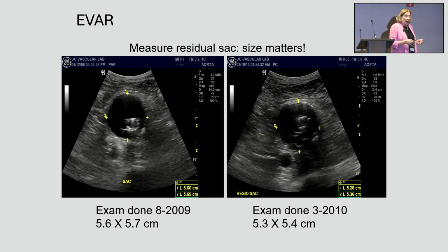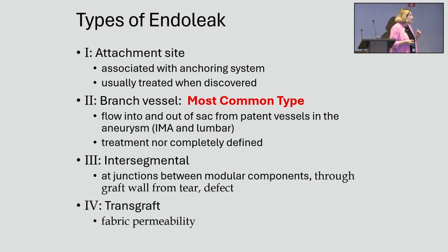And early on, looking at these things, people weren't familiar with it. It's like, I did this aorta and there's this weird thing in there. And we're going to see that in some other things as technology and types of devices develop. You see something, you don't know what it is, ask somebody. So again, compare the size. One was done one year, one was done the next. Look at where they measured and try to measure in the same place.